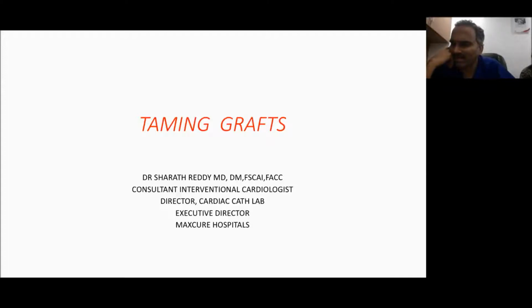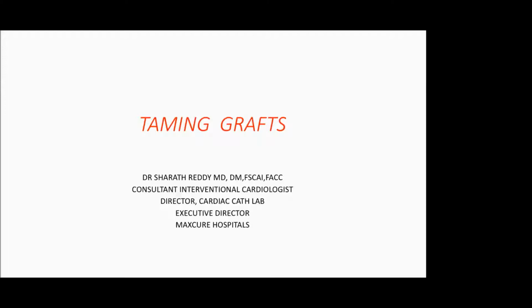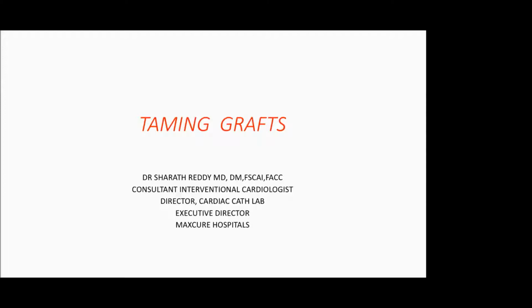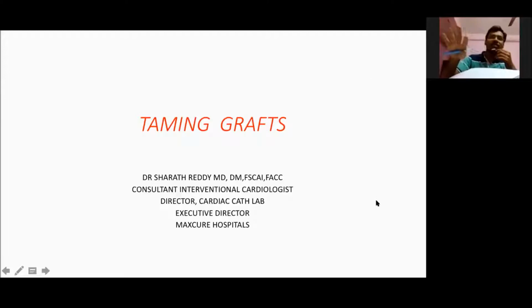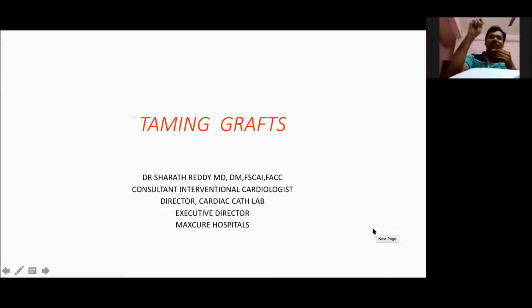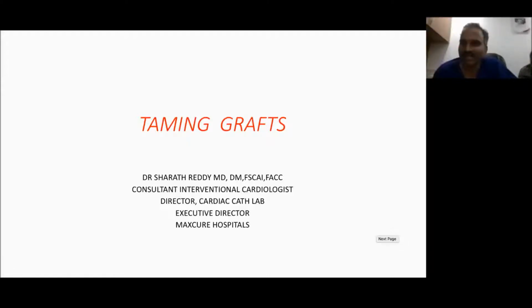Also Lima. So how comfortable are you in engaging Lima or cannulating Lima? Only once they have given me a chance for engaging Lima. That was through the left arm. It was very easy, and it was not a problem. Engaging the internal mammary from the respective hand is very easy.